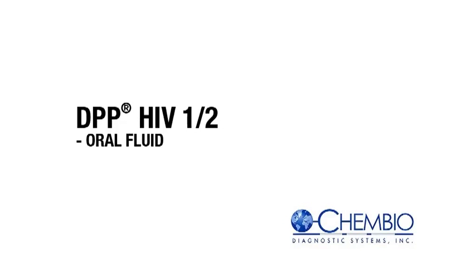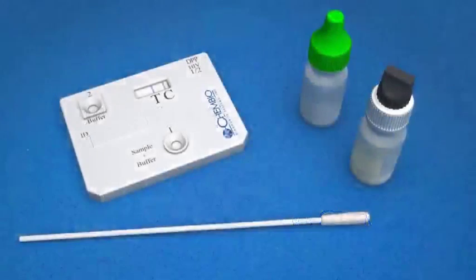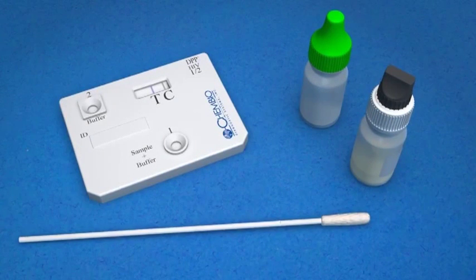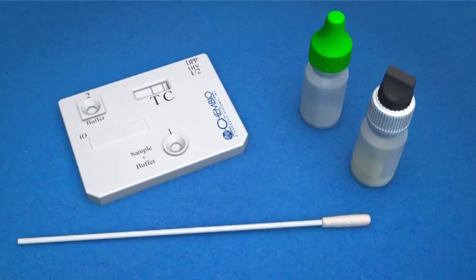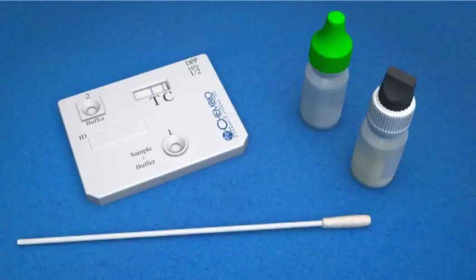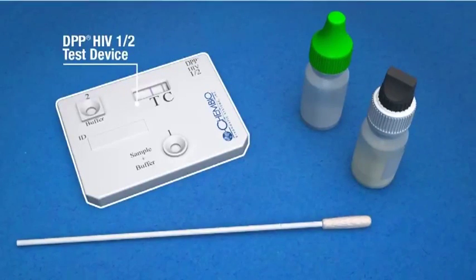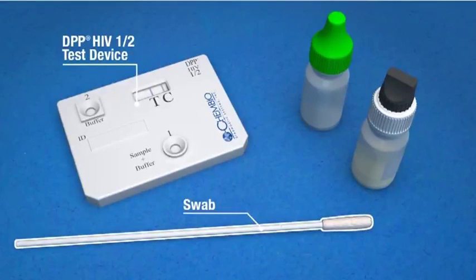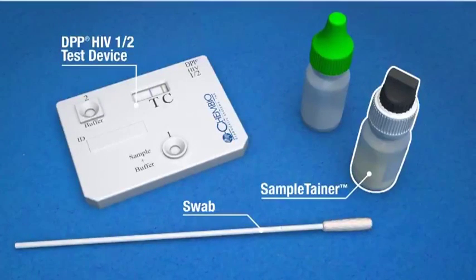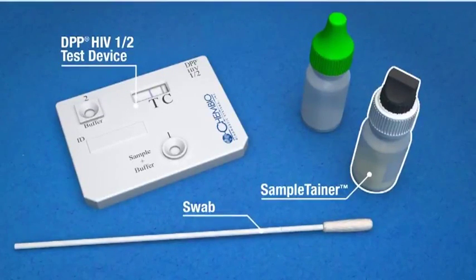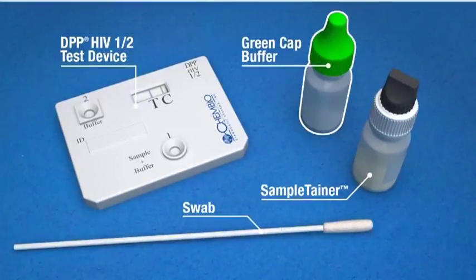DPP-HIV-1 and 2 Instructions for Oral Fluid. The DPP-HIV-1 and 2 assay for oral fluids contains the following components: the DPP test device, an oral fluid collection swab, a black cap sample tainer for diluting oral fluid specimens, and a green cap running buffer bottle.